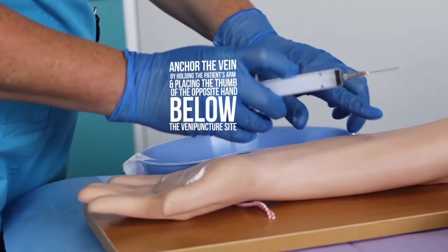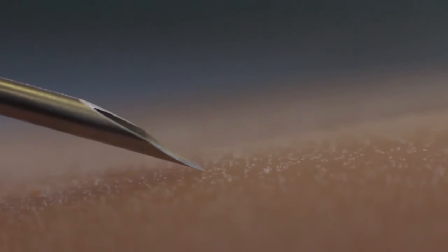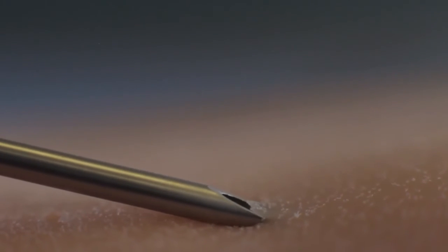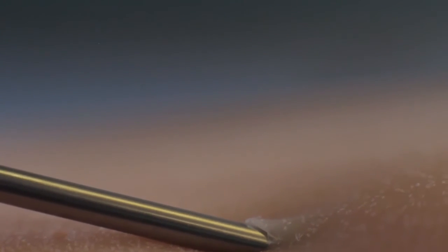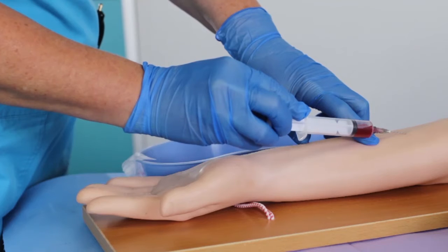Anchor the vein by holding the patient's arm and placing the thumb of the opposite hand below the venipuncture site. Do not bend the needle. Ensure that the bevel of the needle is pointing up. Enter the vein swiftly at a 15 to 30 degree angle. Hold to stabilize the barrel of the syringe and gently withdraw the plunger to fill the syringe with the required amount of blood.